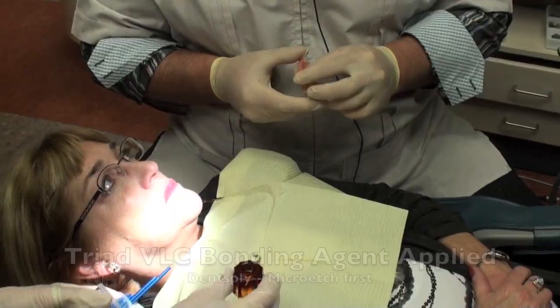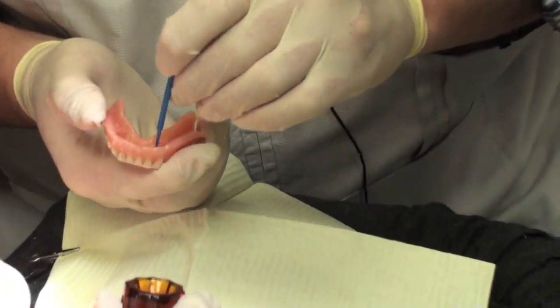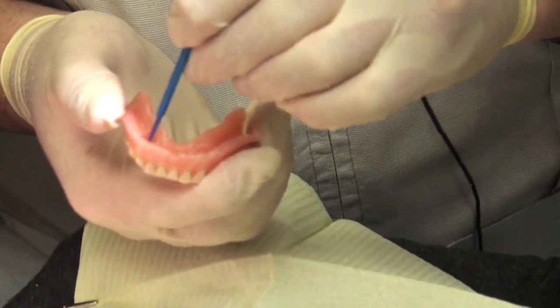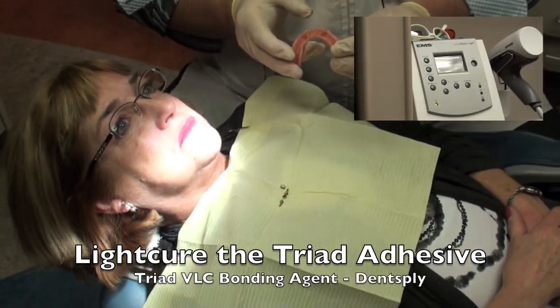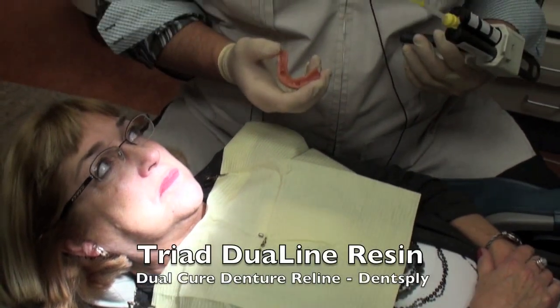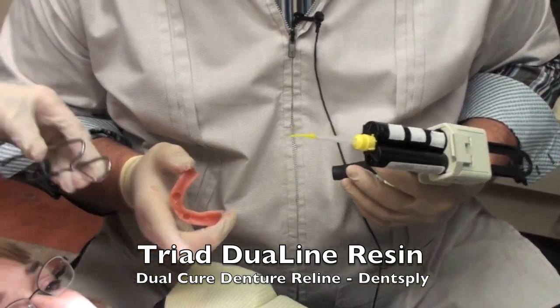We're going to place a little bit of Triad VLC bonding agent on the denture itself after a little bit of micro-etching of the area. The area is going to be retentive that way. You apply the bonding agent and then light-cure it. You can do this in a Triad oven or use your chair-side light — we're using the Swiss Master Light here, which is a rapid light taking about three to four seconds. We do this about four or five times to make sure the Triad VLC bonding agent is fully cured.